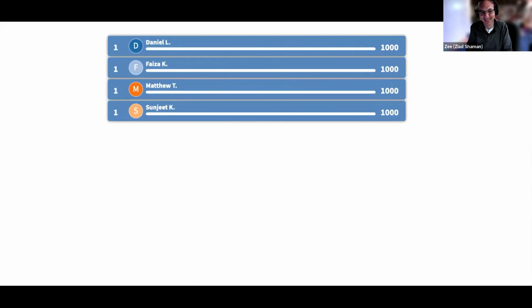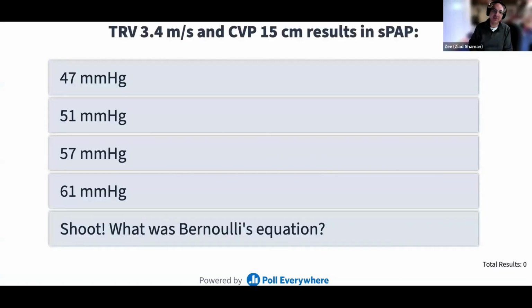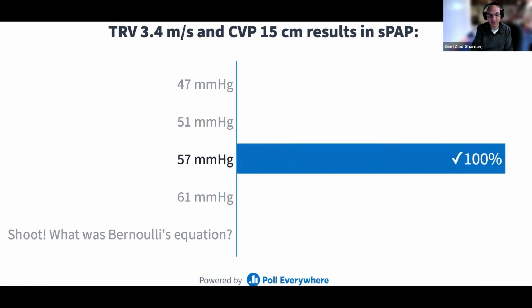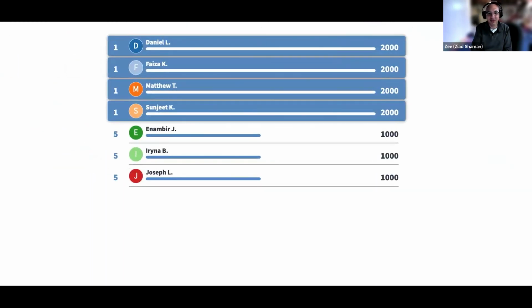Okay. 3.4 meters per second and a CVP of 15 will give you. Timer. Okay. All right. Good.